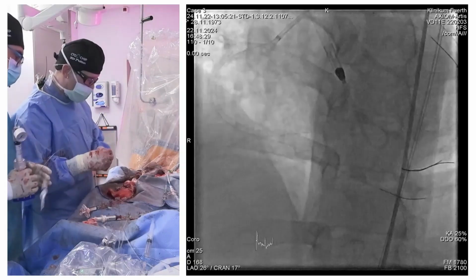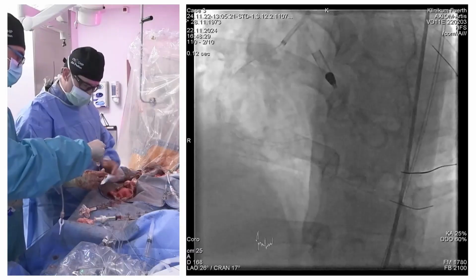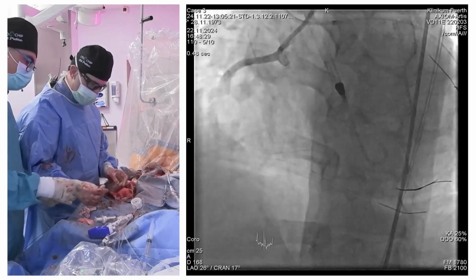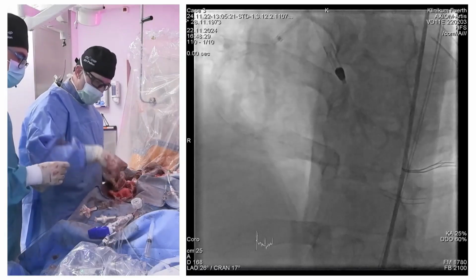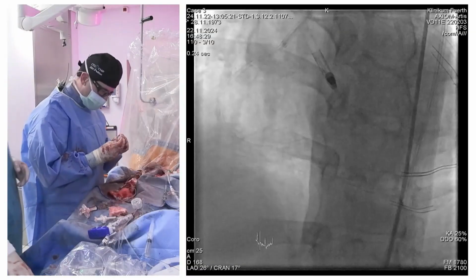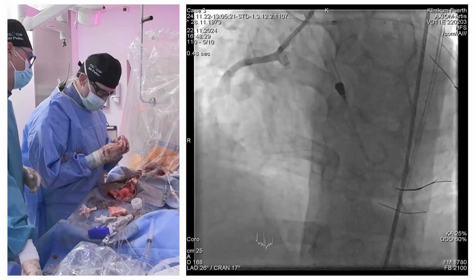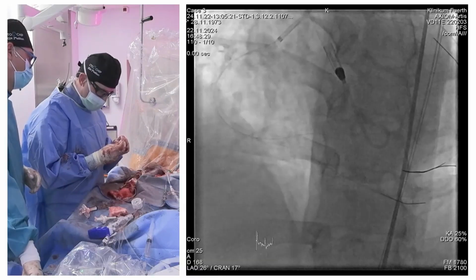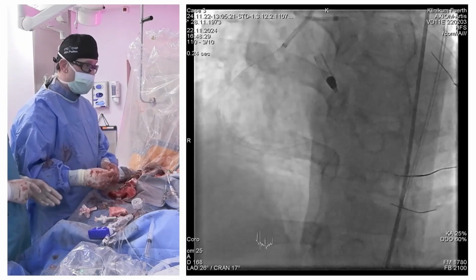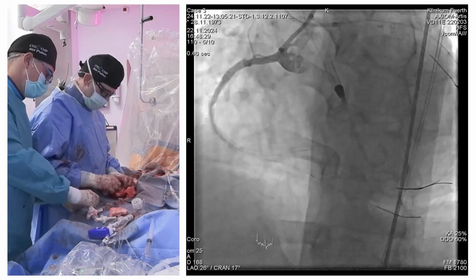The CTO didn't develop in a day, so we cannot expect all the function to come back in a day, right? And I would not overdo it, especially not if you have such a long stent area already, and you have seen the great cases this morning done by Anja, and you could even have thought about not stenting that much and say, okay, the rest might develop, and if not, you can still solve additional issues.